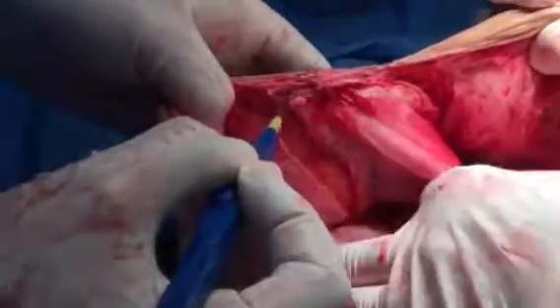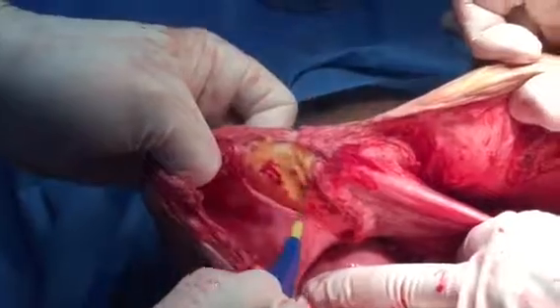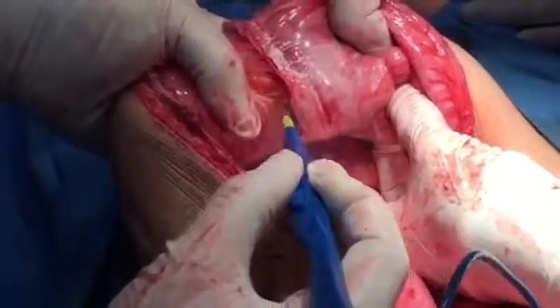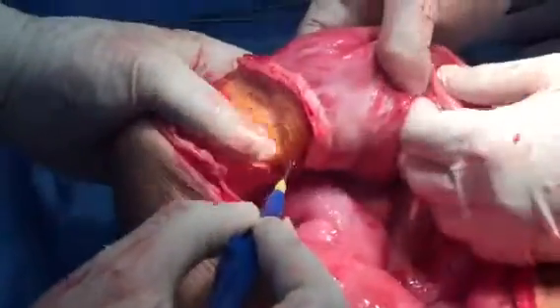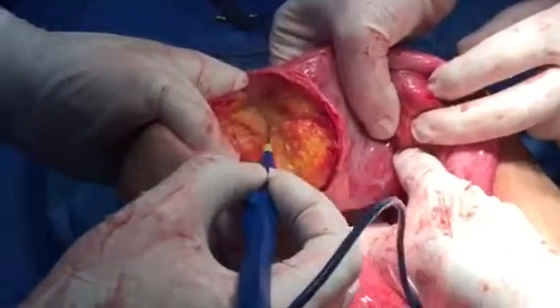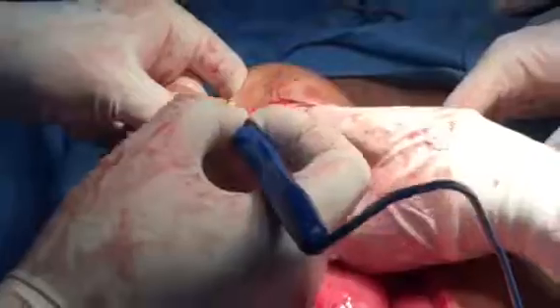Now we remove this adhesion — this is the way. We go all around and take the sheath and subcutaneous tissue until we reach the superficial layer from the deepest portion. This is the way, and the abdominal wall will be easily closed, because the colon was hugely distended. Now I'll remove the skin with it.